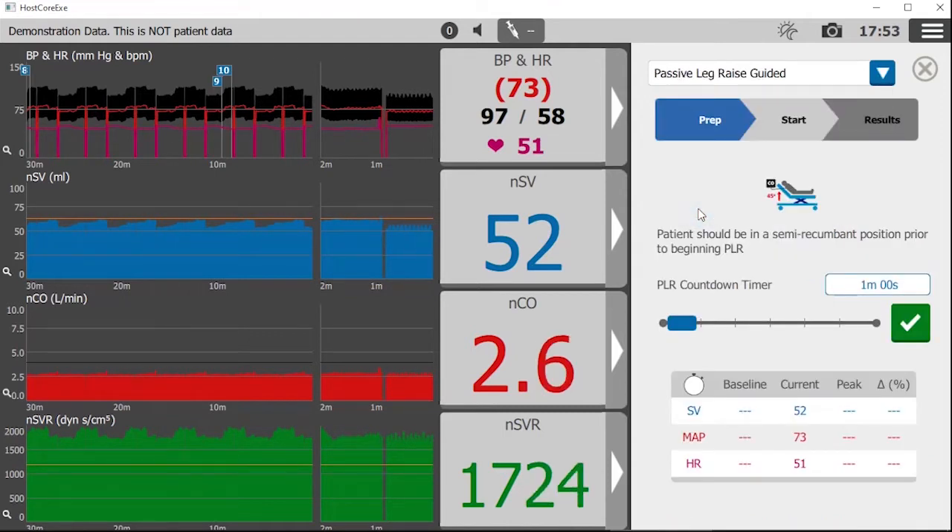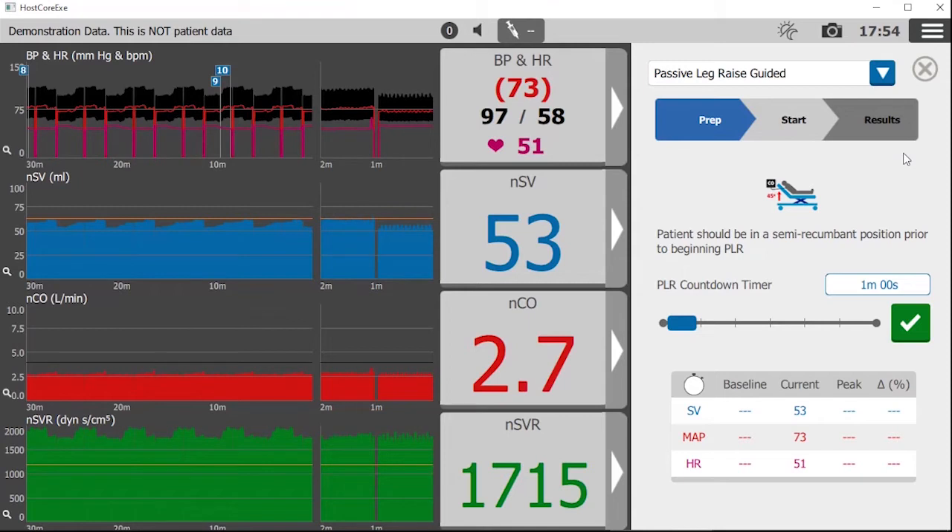Each guided protocol tracks the dynamic changes in three phases — prep, start, and results — and provides a few easy to follow steps.